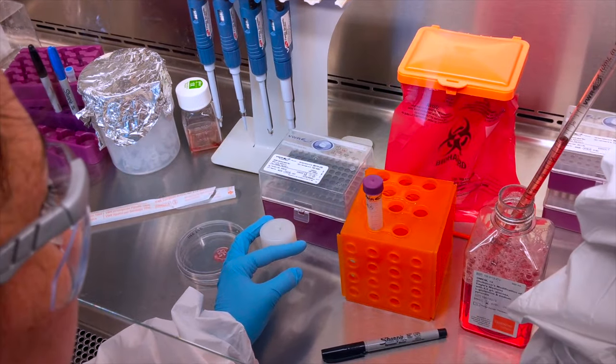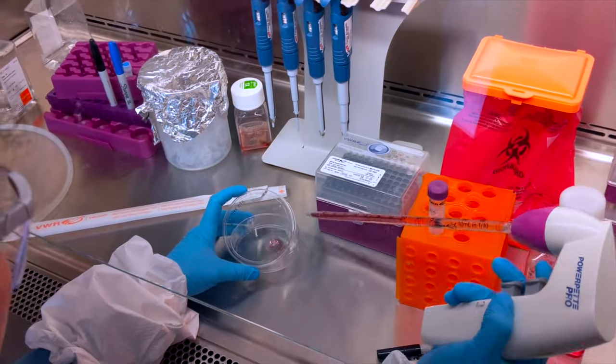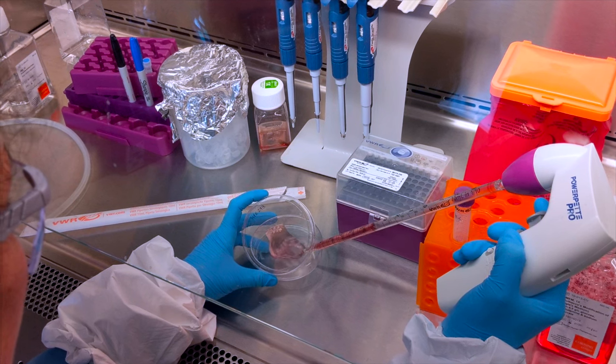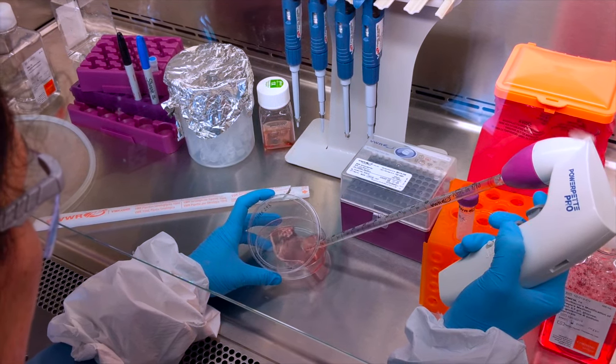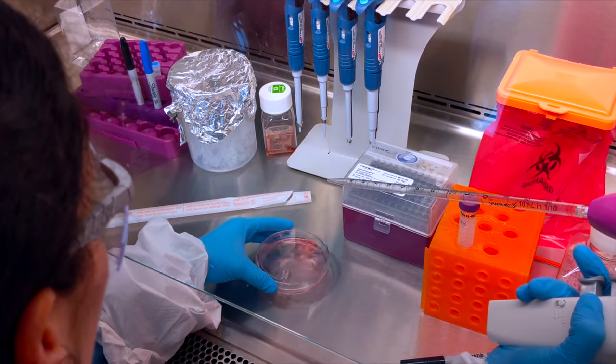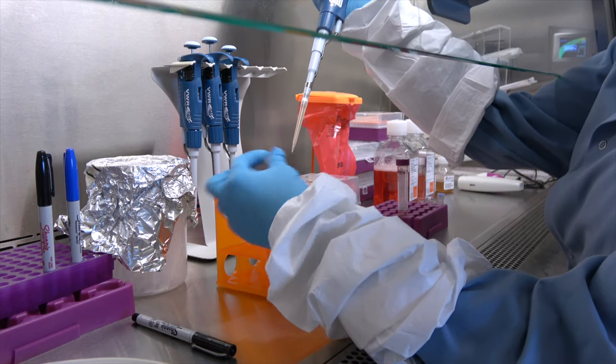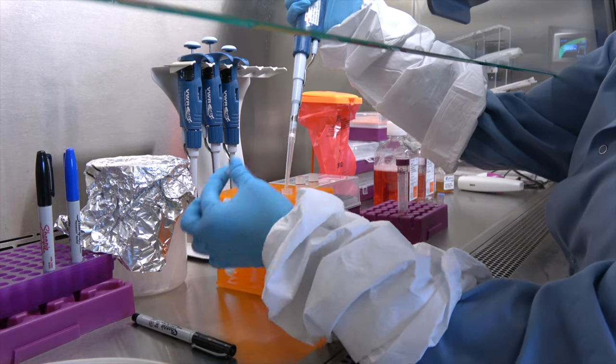As cells are cultured, they will begin to accumulate genotypic variations over time. Consequently, after several months or years of continuous culturing, your cells have probably diverged quite a bit from the parental vial. This can influence the phenotype and the reproducibility of your data. To overcome this challenge, users should create a cell bank of early passage cells.